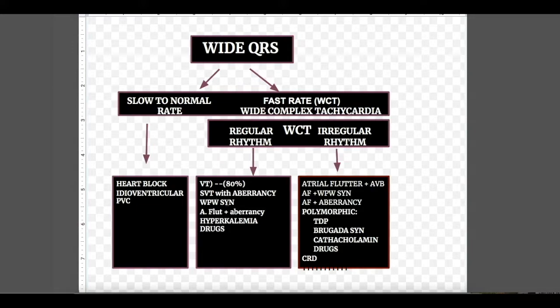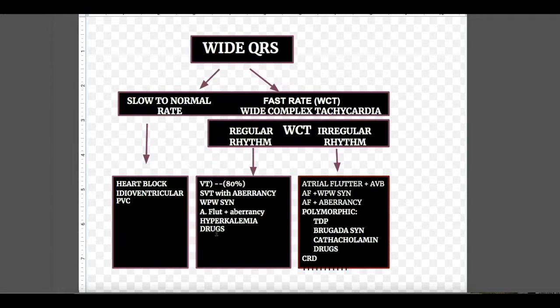Other causes of regular rhythm wide complex QRS tachycardia are Wolff-Parkinson-White syndrome. However, WPW with atrial fibrillation causes irregular rhythm wide complex tachycardia. Hyperkalemia causes regular rhythm wide complex tachycardia, but when potassium level goes very high, it becomes irregular, progressing to ventricular fibrillation. Some drugs also cause regular rhythm wide complex tachycardia, and drugs that prolong the QT interval cause polymorphic ventricular tachycardia.